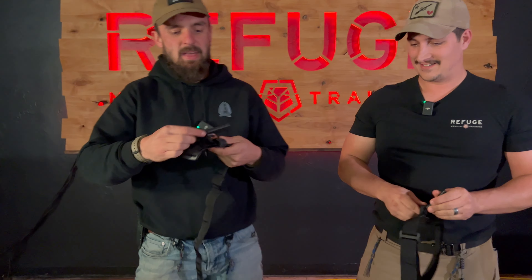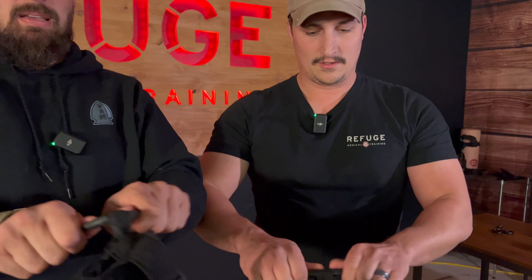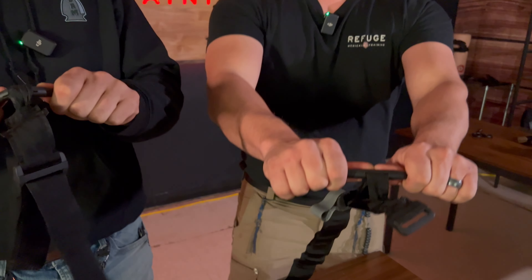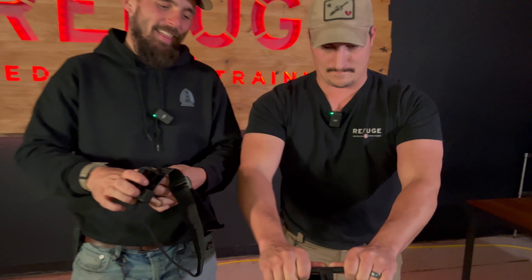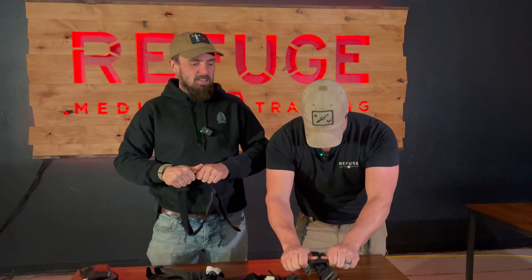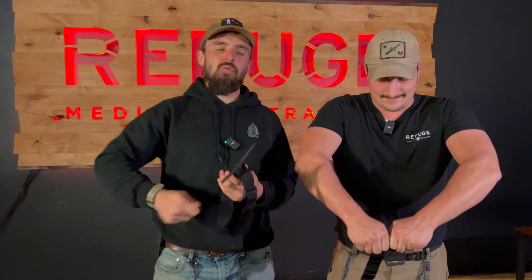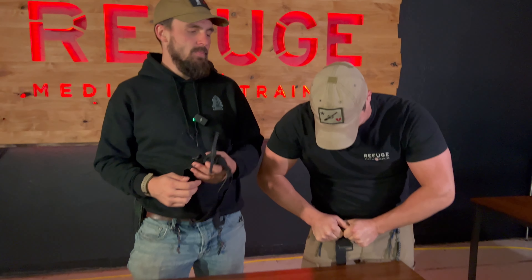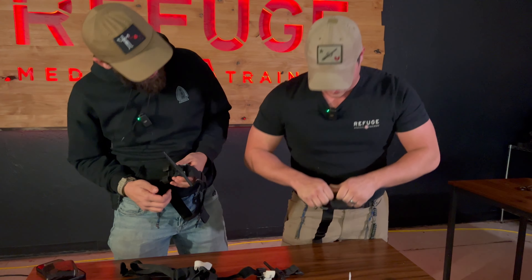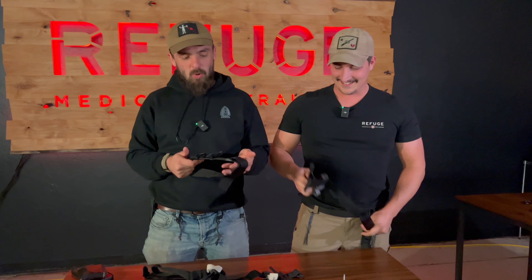Look at that bend — you can't even get it to clip. Is that what you want to trust your life to? I'm going to try to bend the genuine Gen 7 windlass next to him as he bends the fake. I'm not even trying hard — it's just bending on its own. The genuine windlass? That won't bend. That's exactly what we want to see.